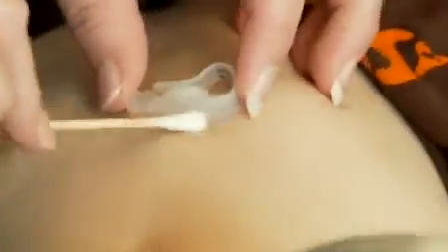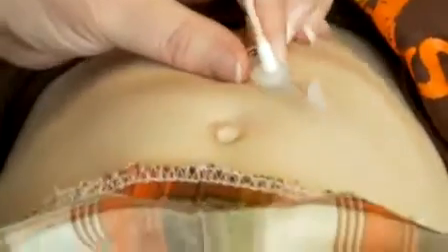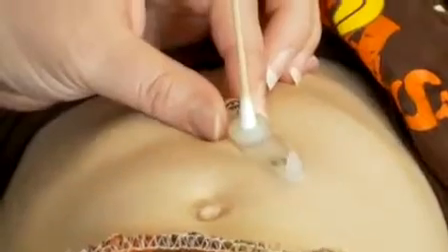Keep the stoma site clean and dry. Wash it daily with mild soap and warm water. Using one end of a swab or cloth, gently clean underneath the device. Using the other end of a swab, clean the feeding port. Turn the button every day to allow for air circulation. You should be able to do a full rotation of the device with little to no difficulty.